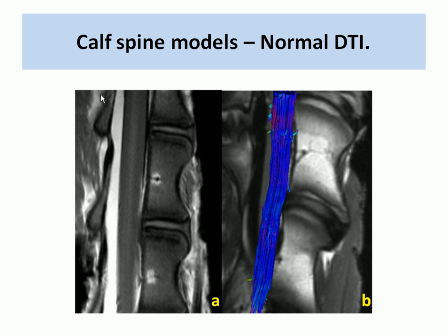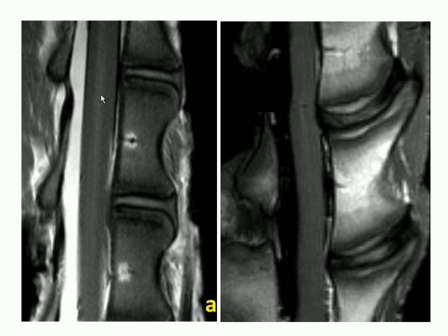So we went ahead to look at a spinal cord model of the calf, and here we got all the exact protocols correct in the animal studies. Here you can see that on a cursory view you may find no major difference between these two, but we have done a stab incision over here, and there is a hemisection of the cord that we have created at the top.